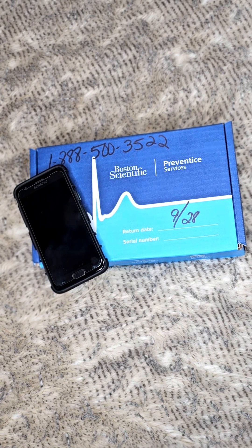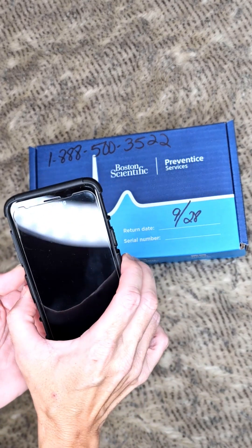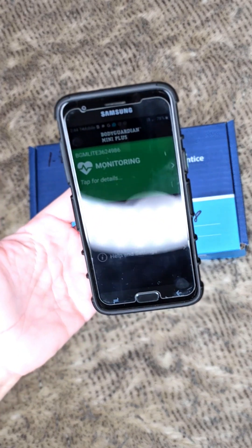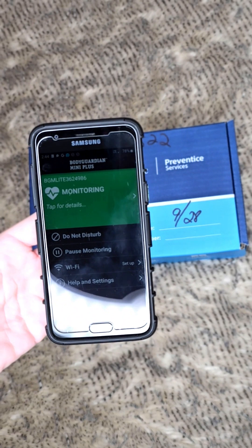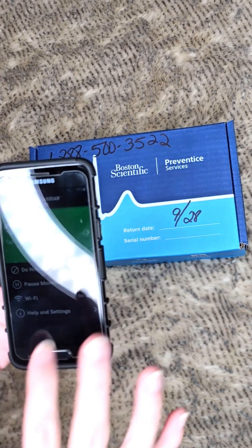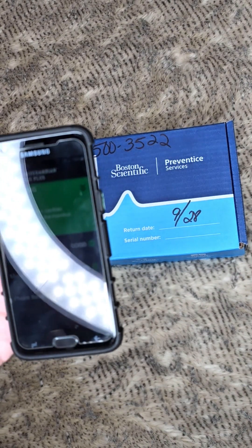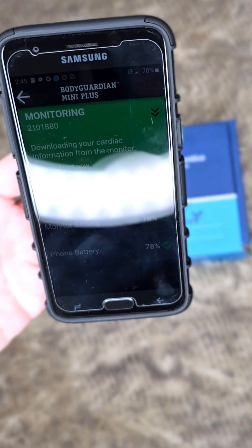I'm going to show you everything that comes in the box with the home cardiac monitor, in case anyone has to do this at home. It's all really simple and easy. You have to keep the phone within five feet of you at all times. If you push the button on the cardiac monitor that's on your body, it gives you symptom options and records them attached to that time on the EKG. If I click 'monitoring' right now, it just shows everything is good — skin contact, placement, battery, and phone battery are all fine.